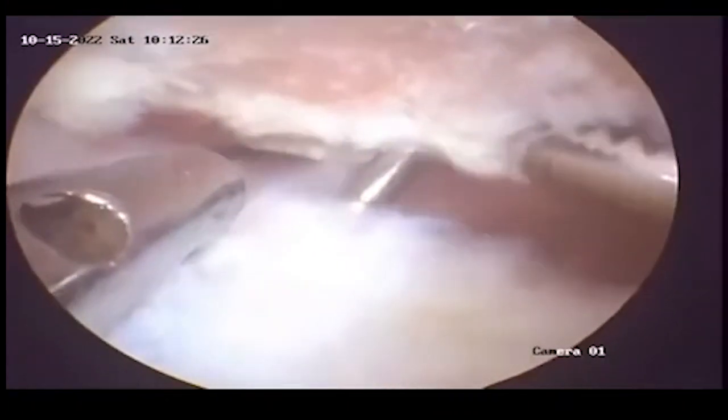The first step done is by using a motorized shaver, a part of the subacromial bursa will be removed in order to visualize the subacromial space. After resection of the coracoacromial ligament from the anterior acromion, the periosteum of the lower surface of the acromion is removed with the motorized shaver.